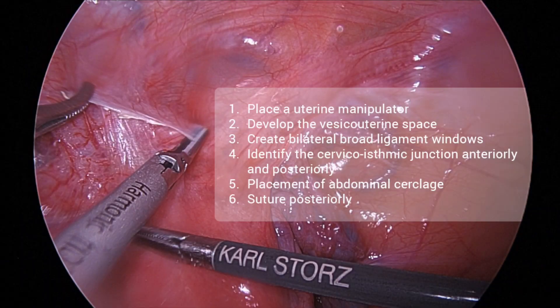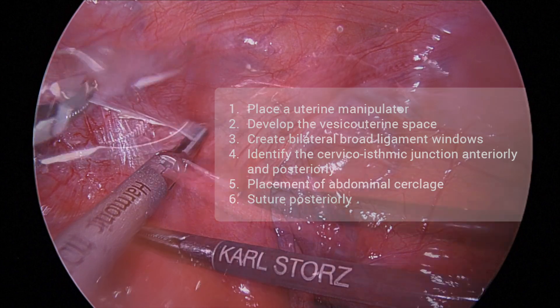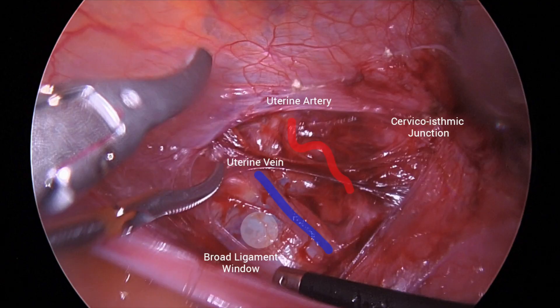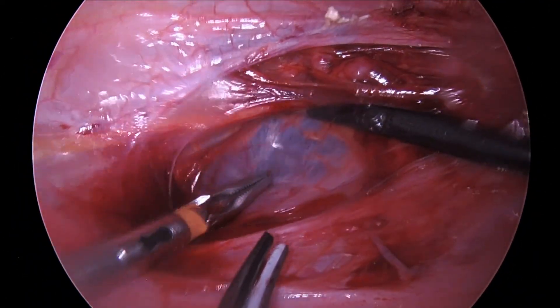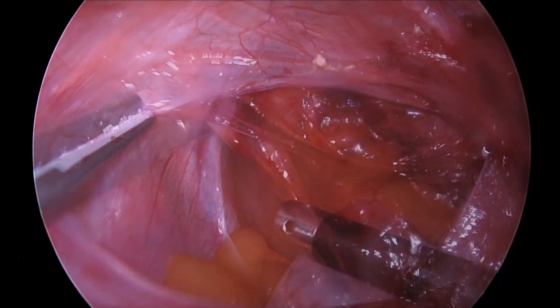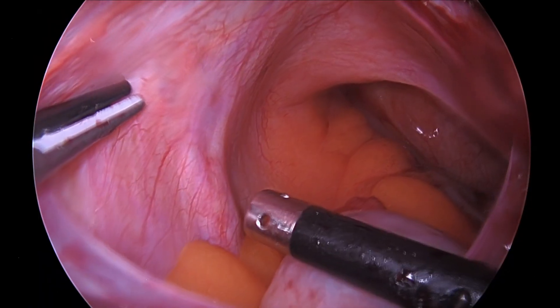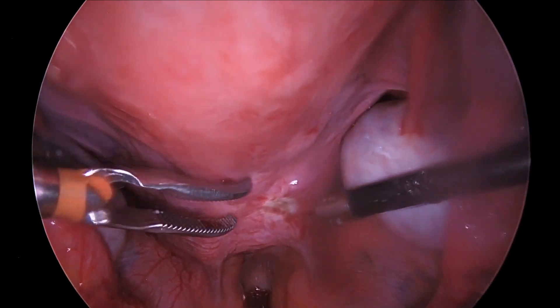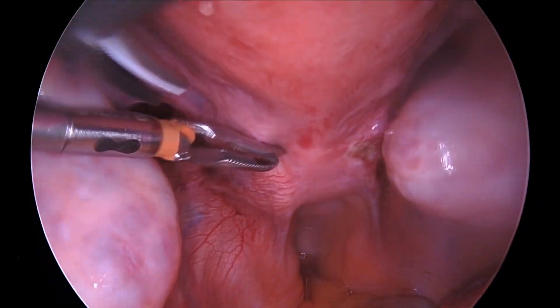We will recount the steps briefly and review specific considerations for surgical planning including timing of placement in relation to pregnancy and specific suture selection. The steps are: insertion of a uterine manipulator, followed by creation of a bladder flap, development of broad ligament windows, identification of the cervico-isthmic junction, and finally cerclage placement and suturing. The ureter is identified through the window created in the broad ligament, repeated on the contralateral side. A uterine manipulator during this procedure is essential to optimize the view of suture placement and identification of the cervico-isthmic junction.